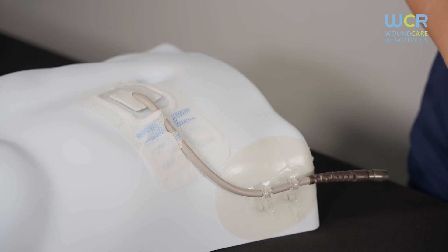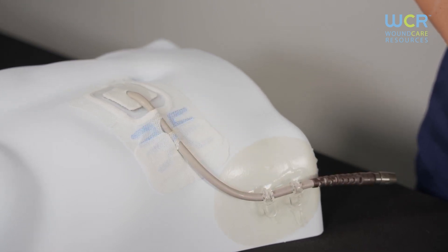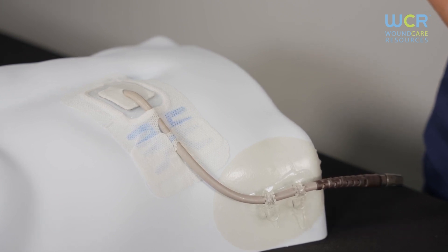Let's get started. Make sure the patient is in a comfortable position, the room door is closed, you have a garbage can within reach, all pets are out of the room, and any fans are turned off.